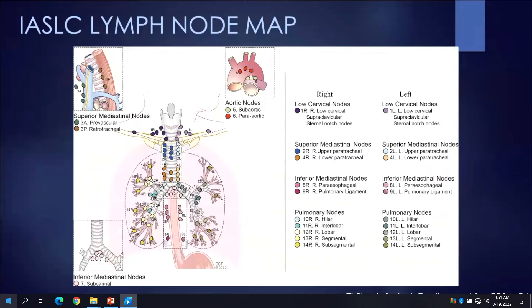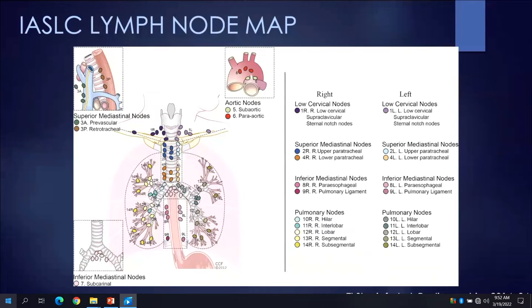For describing sites of nodal disease in the thorax, we most frequently employ the International Association for the Study of Lung Cancer, or IASLC, lymph node classification system, which uses 14 nodal stations to stage lung cancer. In the course of your training, you will each become very familiar with the anatomic boundaries that define each of these stations.